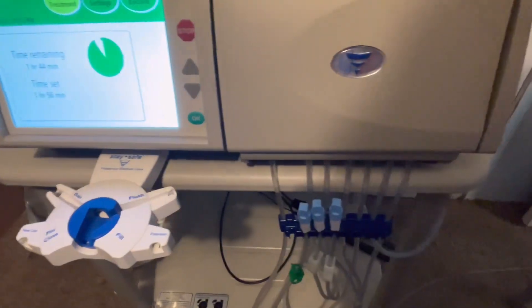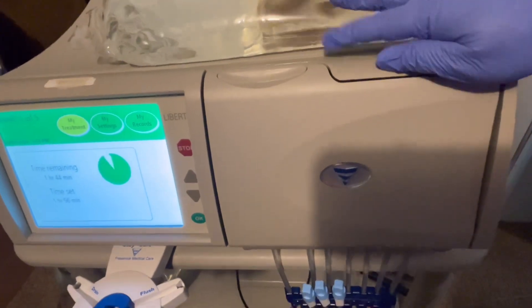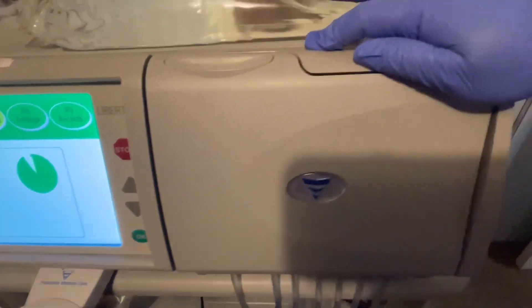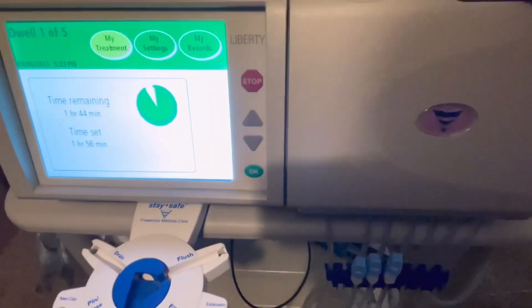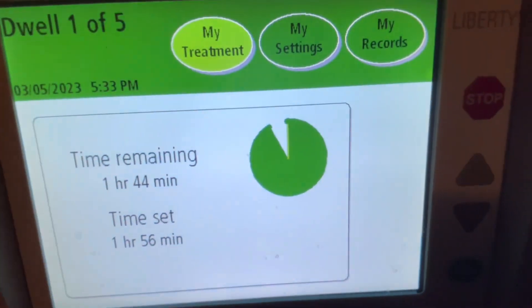There are two types of dialysis: peritoneal and hemodialysis. With peritoneal, instead of cleansing the blood directly, it's like an exchange cleaning from the peritoneal area. This is the machine — right now we are actually doing dialysis.